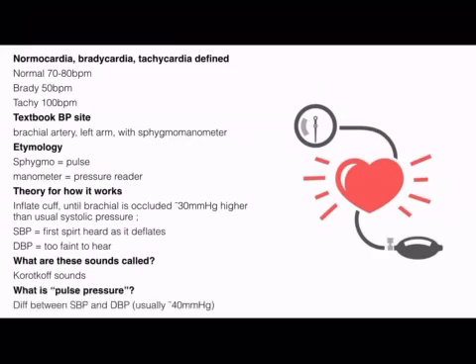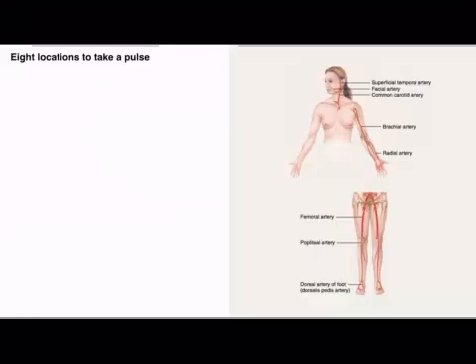So what is pulse pressure? Your pulse pressure is the difference between systolic and diastolic. So if it was 120 over 80, it's usually 40. So you can sort of think that. When you hear the SBP spurt through, even if that's not 120, even if that's 150, 160, 170, you can think, right, I'm assuming that when we get 40-ish down, I'll stop hearing it. So as soon as you know SBP, you can start to really think ahead.